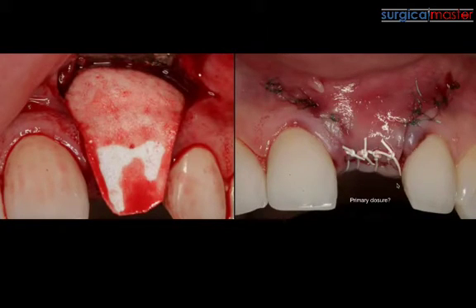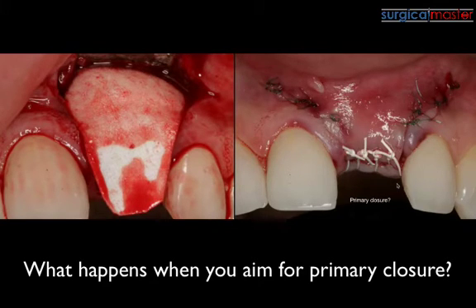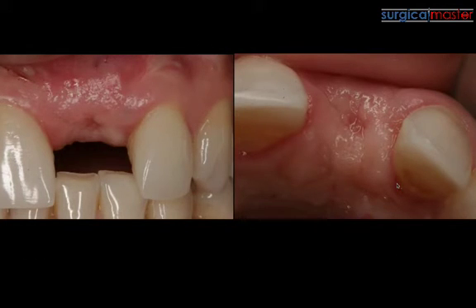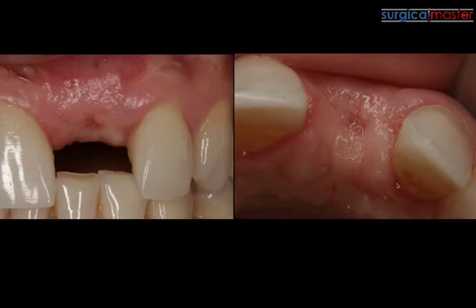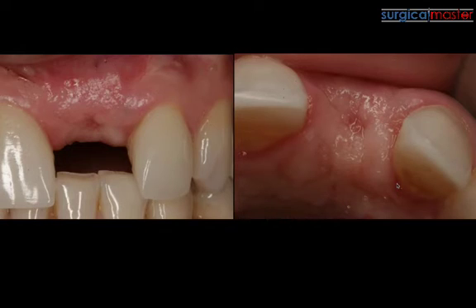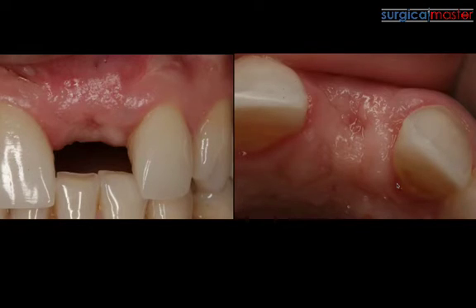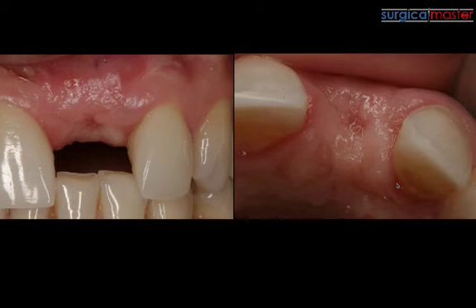In this case I advanced primarily, and the reason I'm showing this to you—we don't do this anymore—I wanted to show you that your bone grafts will heal. But I also wanted to demonstrate what it's going to do to the mucogingival junction. Look at the left picture. You see that the mucogingival junction has been displaced, the soft tissue vascularity has been compromised, and you can create some uncomfortable scar tissue. You can reposition it at the time of implant placement, but don't aim for primary closure. That's really one of my key tips. Keep it open. Don't forget that extraction sockets naturally, without any grafting, heal quite well being left open, and the body has a mechanism of creating good attached and keratinized tissue—not just good bone, but also soft tissue that is advantageous for the next step.